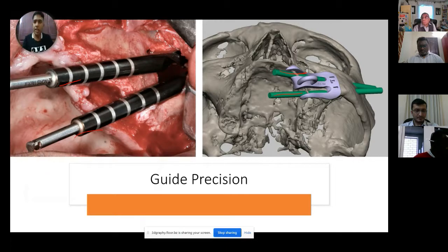Good. And this is very important for zygomatic implants, especially in quad zygomas, because we have very little place to go plus or minus. We can't do that. We have to be bang on target, especially in quad zygomas, because you can see this is all we have. This is all the width I have. So you can see the width is this and the height. This is all the height I have.